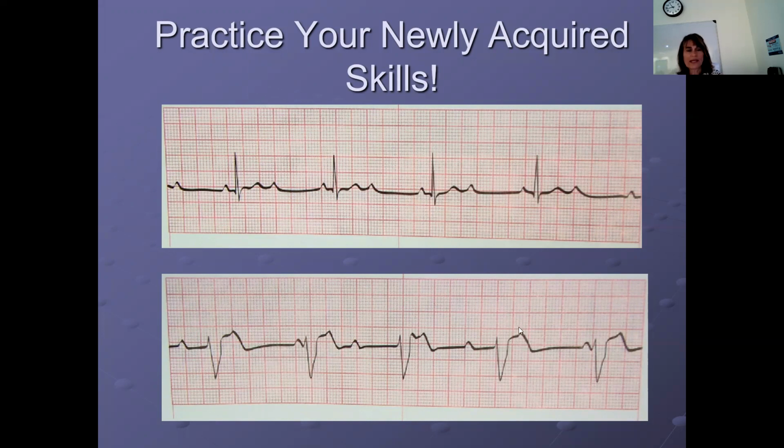All right. So you're looking at this, you're seeing a slow ventricular rate, seeing a wide QRS. PR intervals look like they're all over the place. So what you'll do is you'll measure the P waves and see if they're all the same distance from each other. And that tells you that the P waves are sending out conduction in a rhythmic form, I guess. And then the ventricles are all the same space apart. So they're doing their thing. And then you come to the conclusion that you're looking at complete heart block.